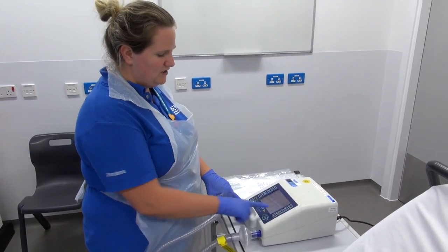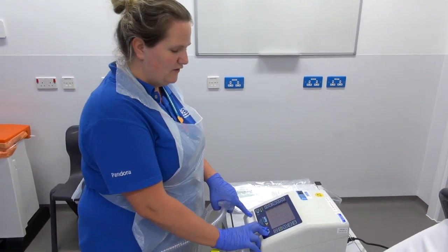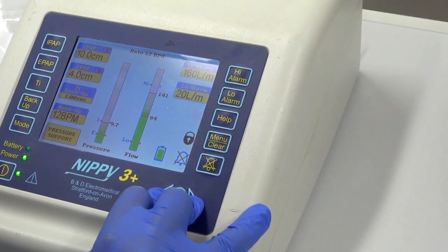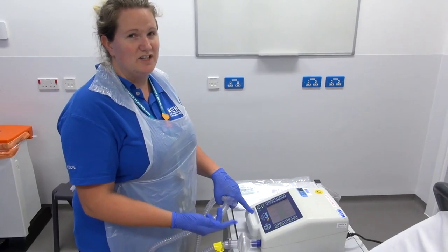To change any of these settings you'll need to unlock the machine. To unlock, press the plus and minus buttons together for 3 seconds and it will unlock. You do the same again to lock the machine.